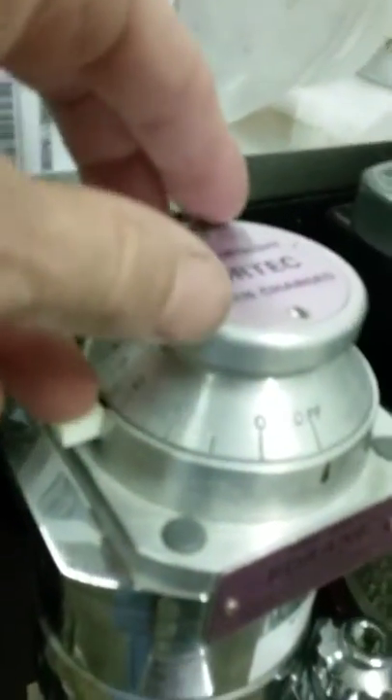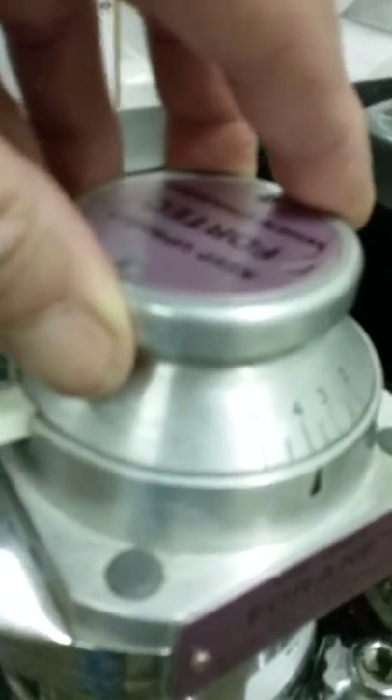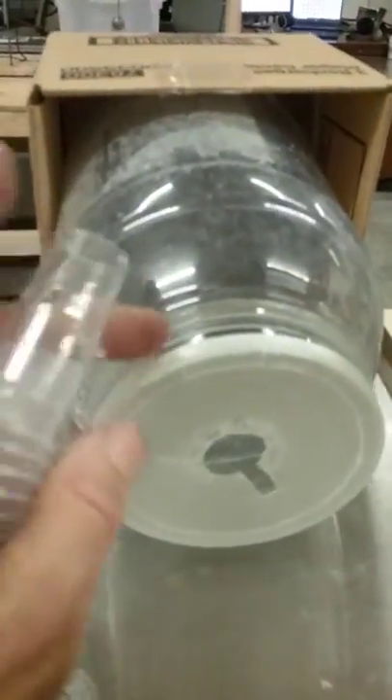That will be our isoflurane reservoir. Turn on the isoflurane by pushing down this little key and then taking it from the off position into the numbered percentages. Typically when we anesthetize an animal we put it up to about four percent — you'll hear it click into place. That is the percentage of isoflurane being blown out of this tube into the jar where the rat will be placed.